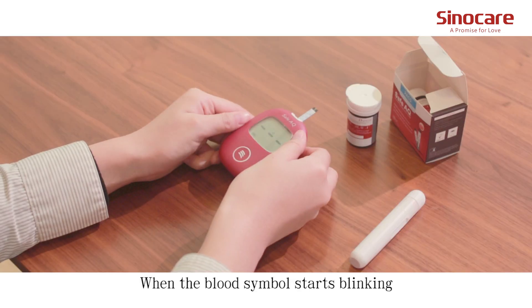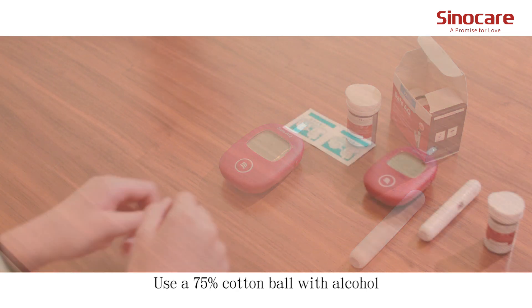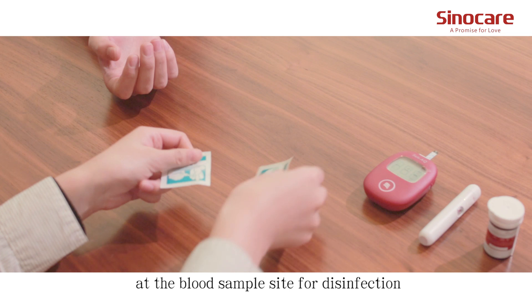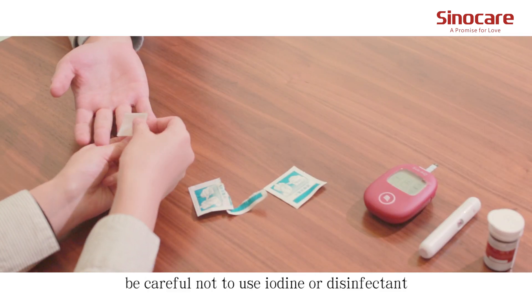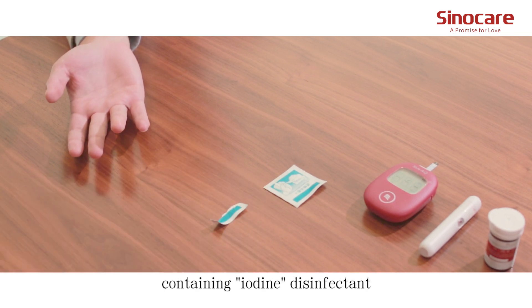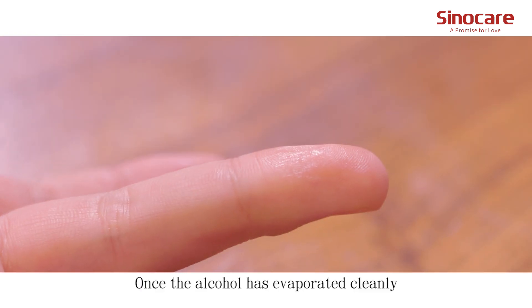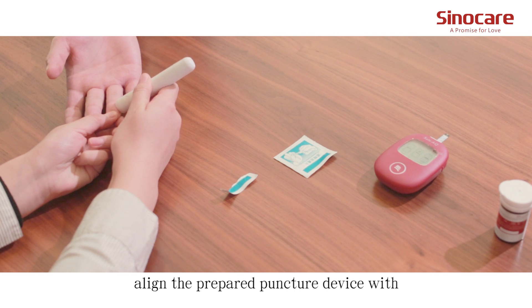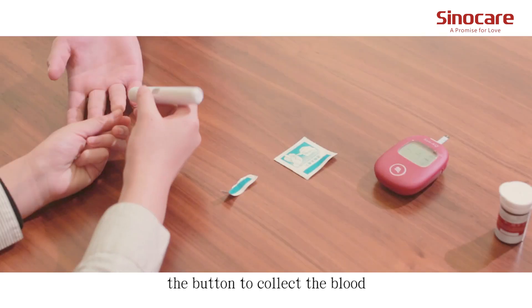When the blood symbol starts blinking, the meter is ready to use. Use a 75% alcohol cotton ball at the blood sample site for disinfection. Be careful not to use iodine or any disinfectant containing iodine. Once the alcohol has evaporated, align the prepared lancing device with the disinfected skin and press the button to collect the blood.